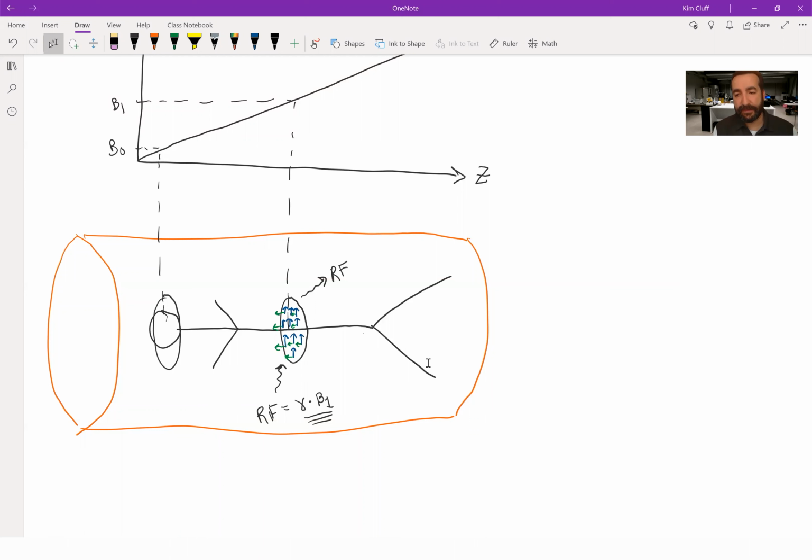So that can be done in computed tomography as well, in CT. Computed tomography, you can inject a contrast agent into the vasculature that has a different attenuation coefficient than what's natural to the body. So you can see the exact shape of the vasculature because you filled it up with this contrast agent that has a different attenuation coefficient. So we'll go ahead and end here.